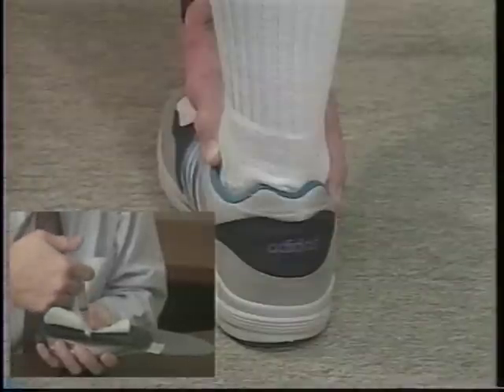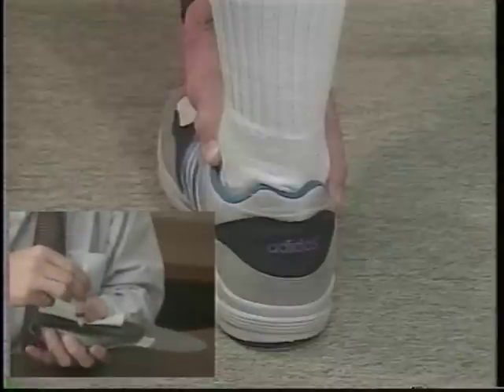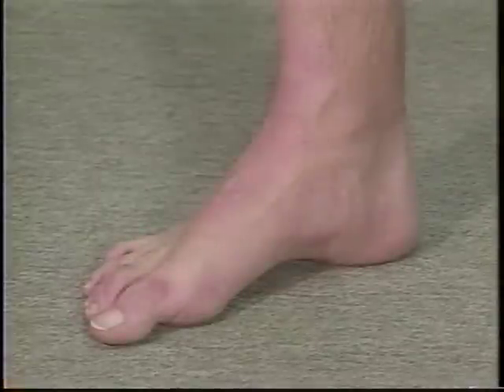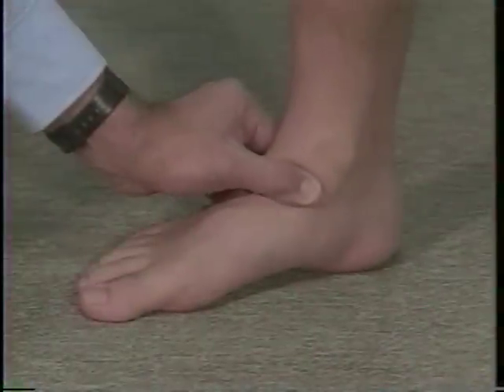The weight bearing neutral position molding is superior to any other molding or casting technique since it takes into account not only intrinsic deformities of the foot, but also extrinsic deformities. By aligning the foot in neutral in the actual functioning position, a precise support is automatically constructed.